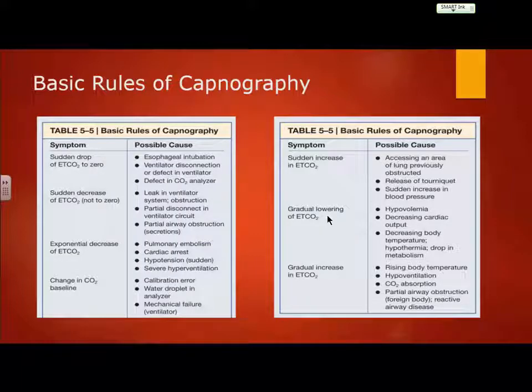If I've been bagging and we've got a good waveform, and suddenly it drops, now I know I need to assess my patient. What's the first thing I'm going to listen to? I'm going to check lung sounds first, then I'm going right to the guts, right? Then I'm going to check compliance, then chest rise and fall, then I'm going to look at, does this 70-year-old man suddenly look like he is 36 weeks pregnant? That happens. That stomach will get really big, all right?